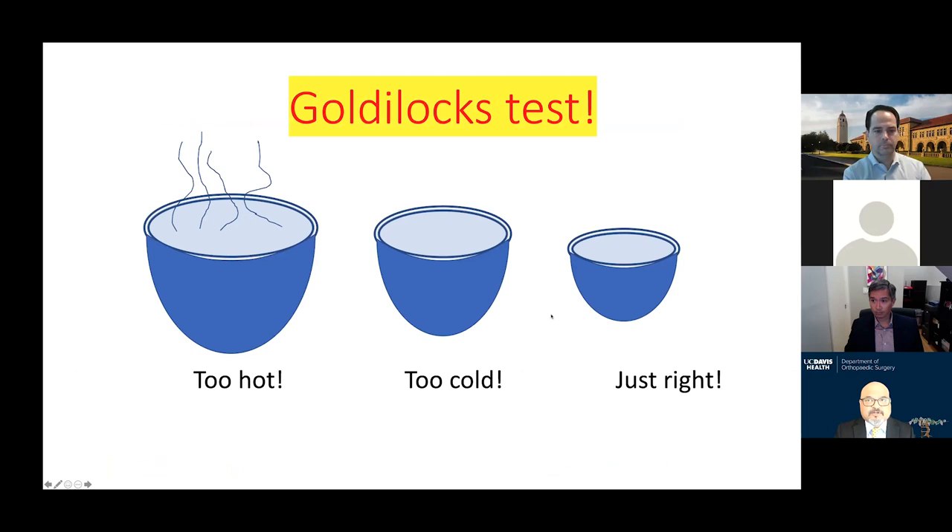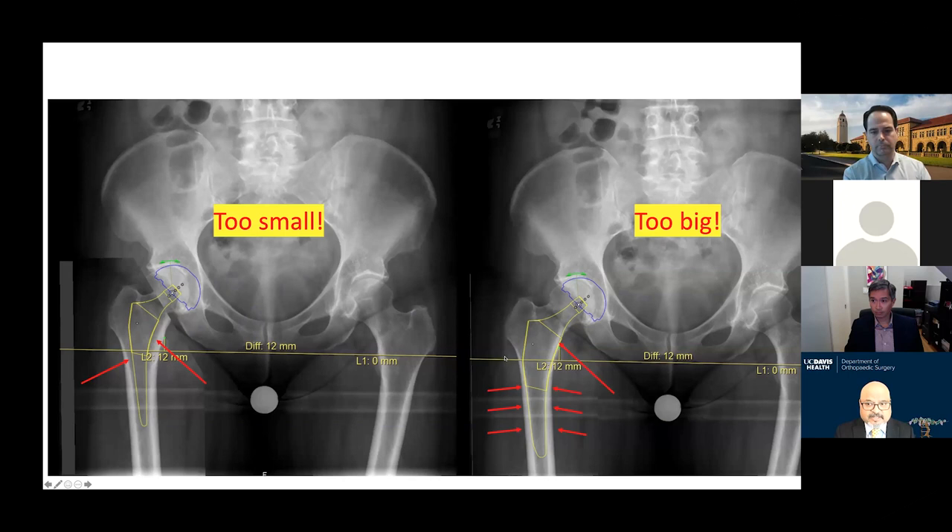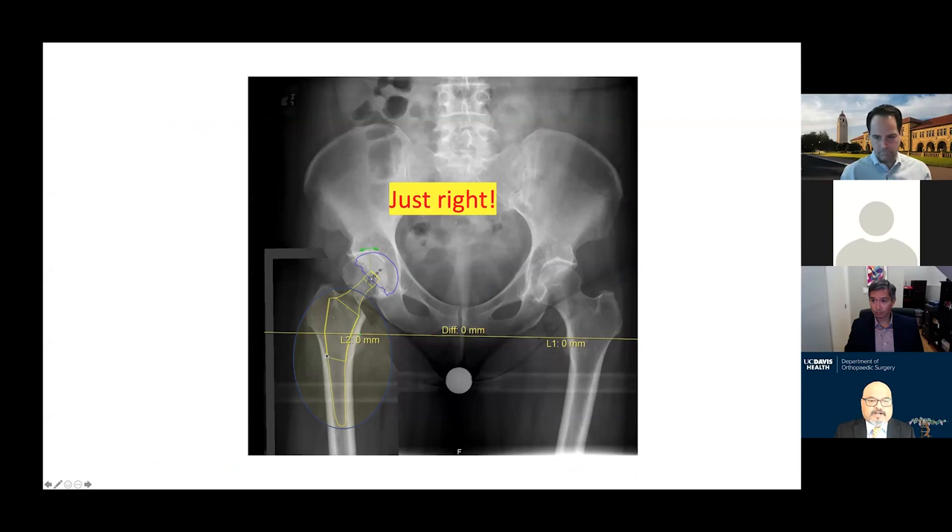Once you know the leg length discrepancy, we go to stem sizing. I use the Goldilocks test — I try a small stem, too small; I go up to an extra large stem, too big; then I find the sweet spot where I see just a little sunlight between the implant template and the cortex. I know this stem is appropriately sized. I also want to see that the calcar of the implant matches the calcar of the femur.